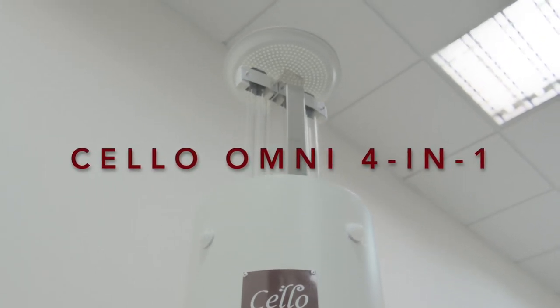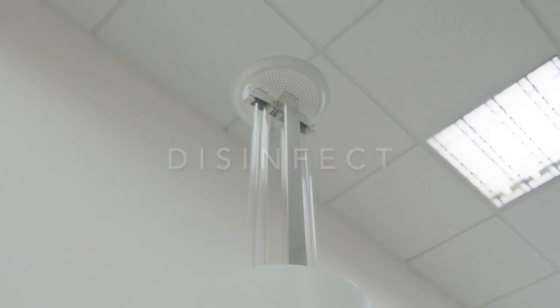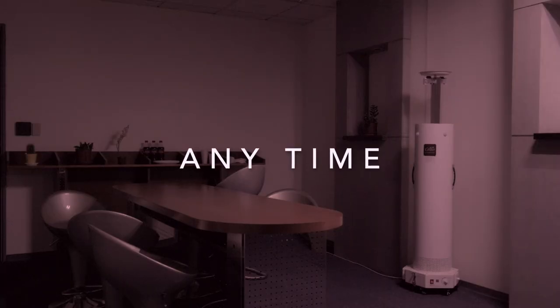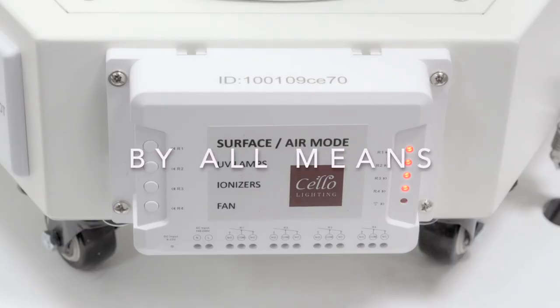With Cello Omni 4-in-1, users can disinfect any time, anywhere, by all means.